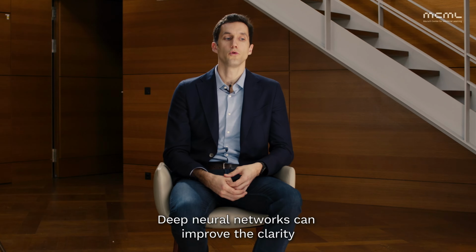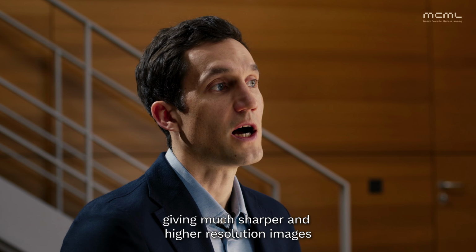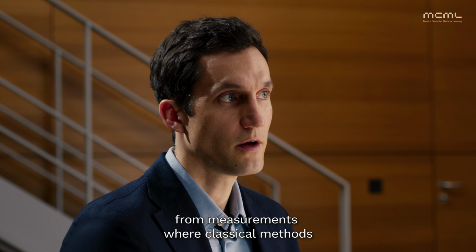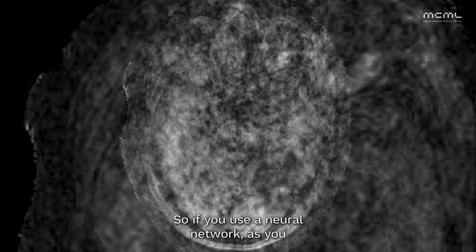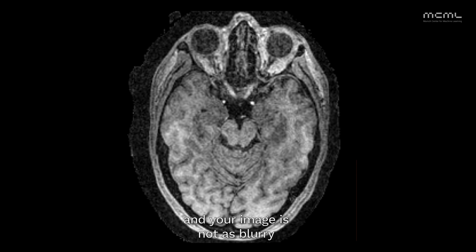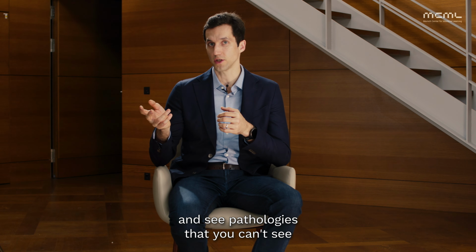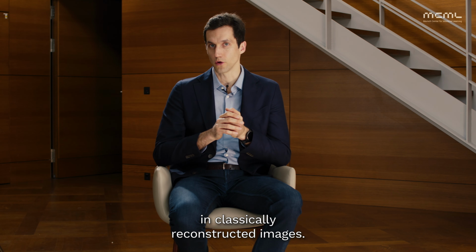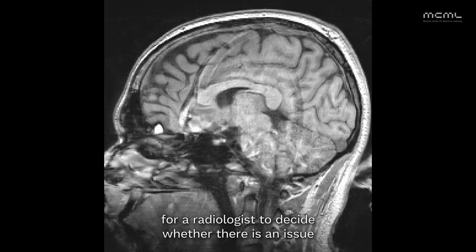Deep neural networks can improve the clarity and diagnostic value by giving much sharper and higher resolution images from measurements where classical methods just don't do as well. So if you use a neural network, as you can see, for example, here, you get just much more details and your image is not as blurry, and you can sometimes detect pathologies that you can't see in classically reconstructed images. So it can really make the difference for a radiologist to decide whether there is an issue or whether there's no issue with the patient.